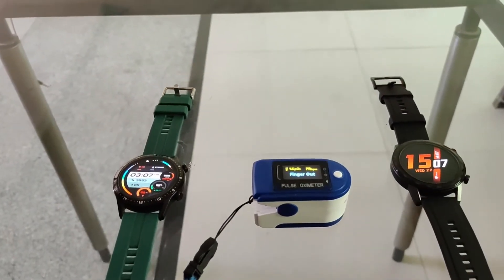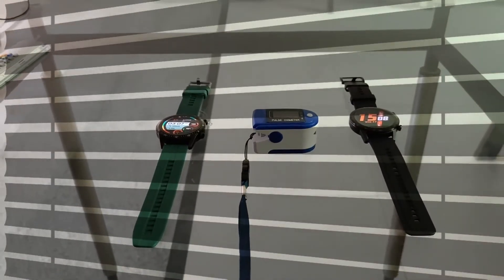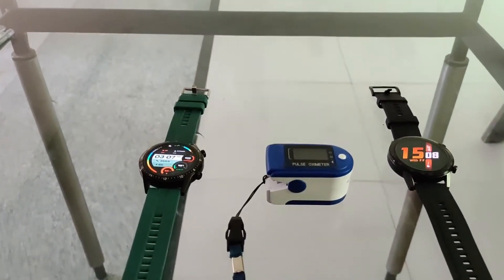Hello everyone! In this video we will quickly compare the SpO2 levels measured using a Huawei GT2, Honor Magic Watch 2, and a pulse oximeter. Let's start!